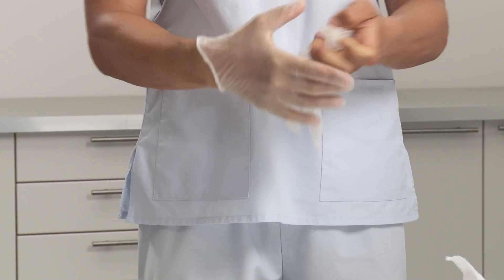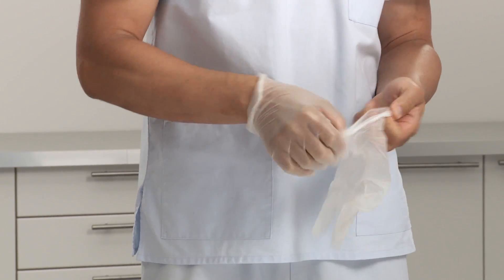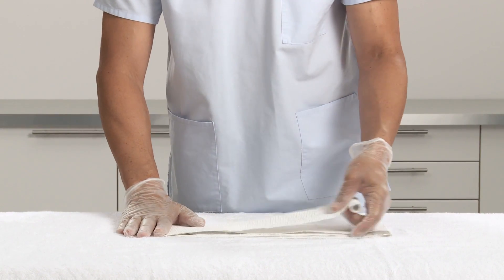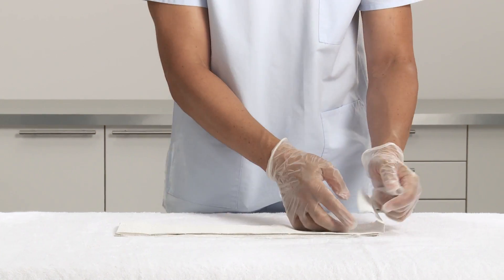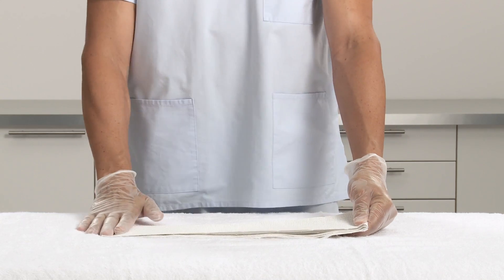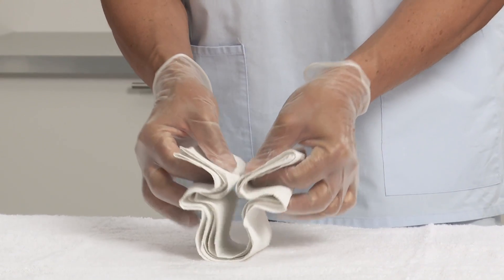It's recommended to wear protective gloves before applying Plaster of Paris. Select the appropriate width of the Plaster of Paris bandage. Fold the bandage into six layers at the length needed to fit the patient. Pick up the bandage in a zig-zag shape.